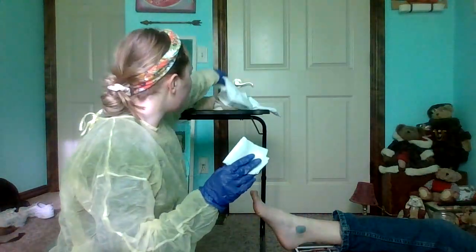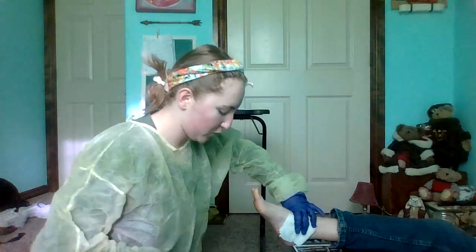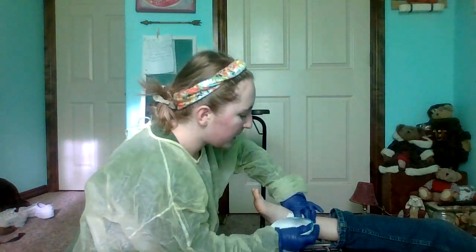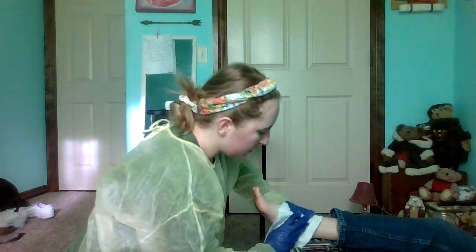A key point to point out is anything that touches the wound or the exudate, you would put in the biological hazard bag, so that red bag. So I'll do this first. I have my one dressing nice and ready. Put that on here. A good thing to note, if your patient is ambulatory, is to put their ankle in more of a dorsiflexed position. That way they're able to still walk. And you also don't have to cover up the toes if they're going to be walking. But you hold that on there.